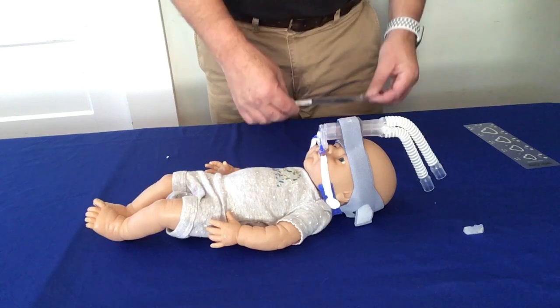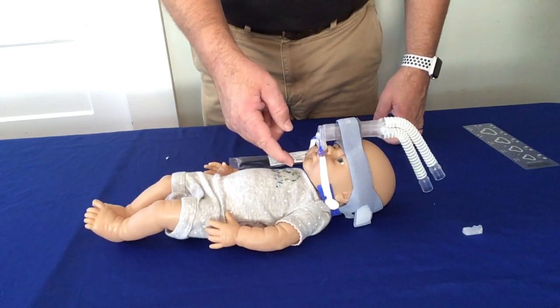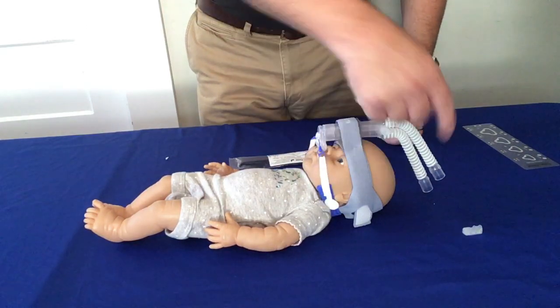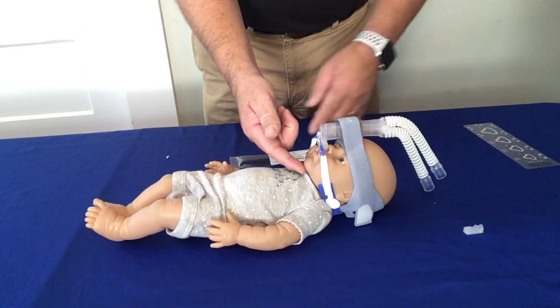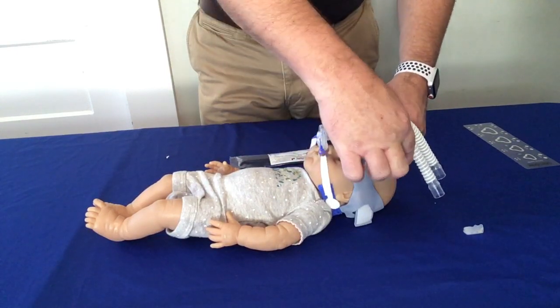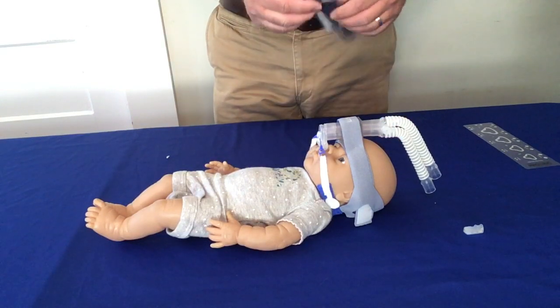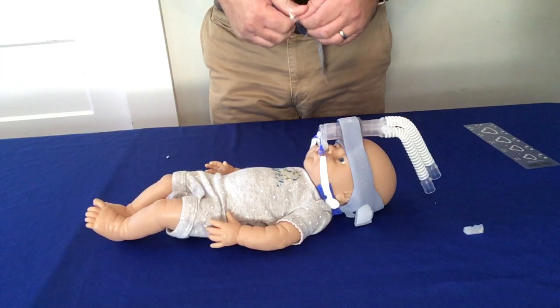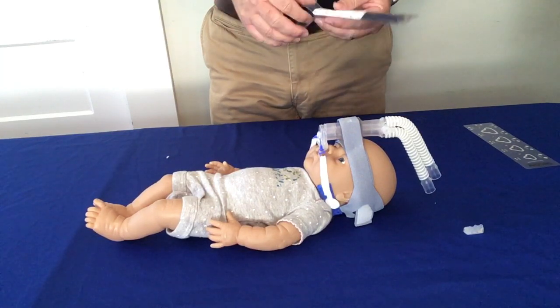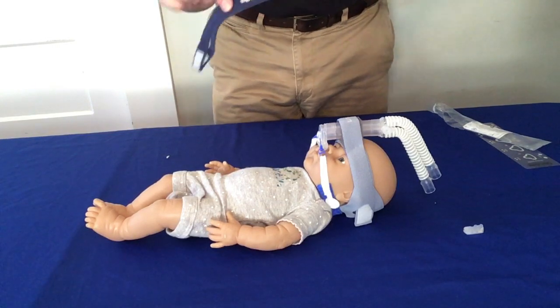When you choose your chin strap, you do need to take a second circumference, and it'll be the circumference of the baby's face. So you'll need to run tape underneath the baby's chin, over the top of the baby's head and then back around again. This baby has a 35 centimeter face, and if you recall, I said the baby had a 32 centimeter circumference head, so it will be different typically. And I have a 32 to 38 chin strap.